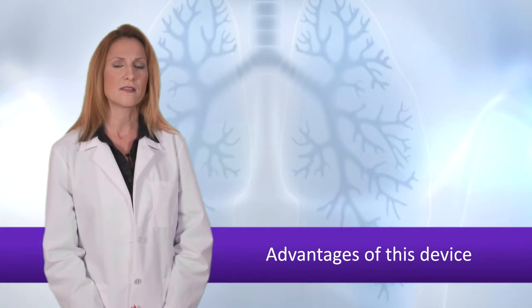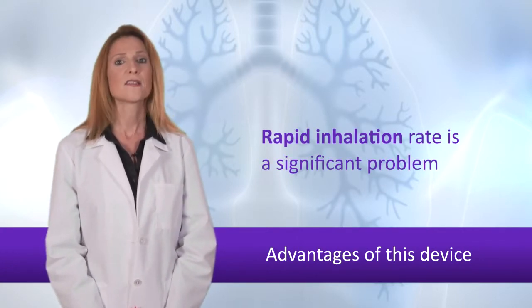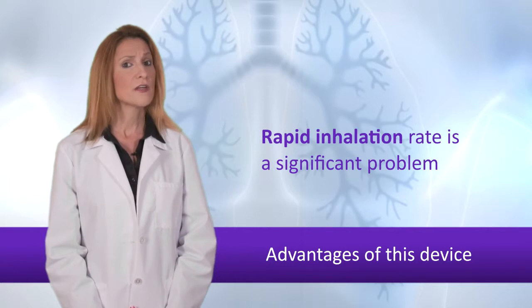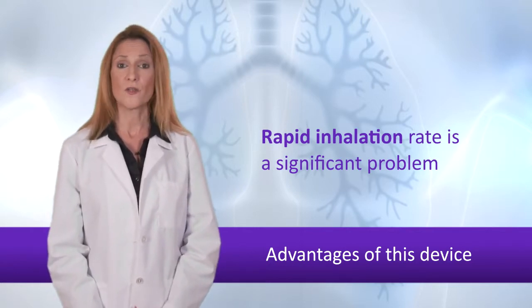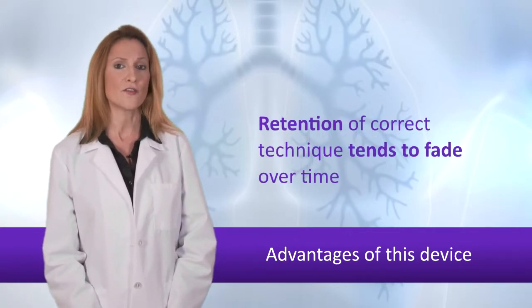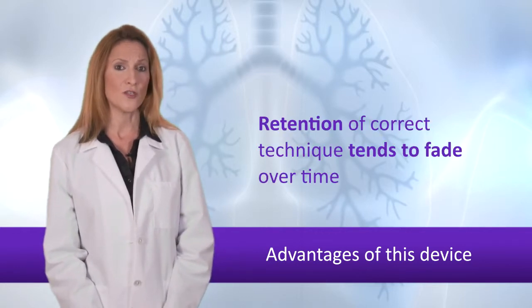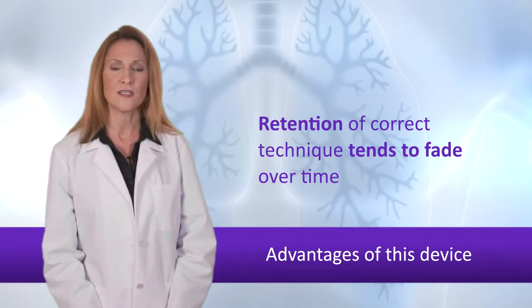Advantages of this device. Rapid inhalation rate is a significant problem. It is especially problematic in patients using both dry powder and metered dose devices on a regular basis. The very different inhalation rates can be confusing. It is also helpful for young children just learning to use inhalers. Retention of correct technique tends to fade over time. This gives the patient a way to gauge their technique at home. This provides the healthcare professional with an objective versus subjective assessment of the patient's inhalation rate.